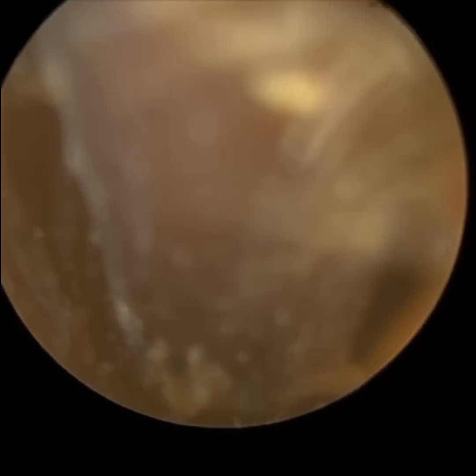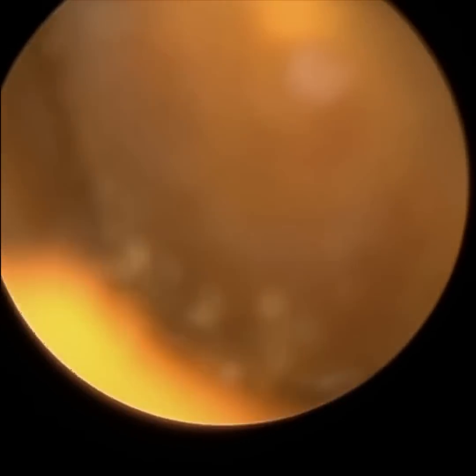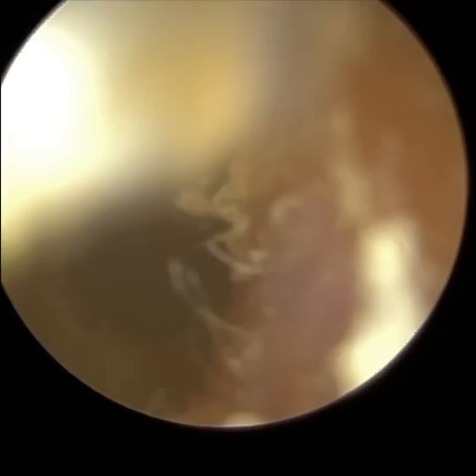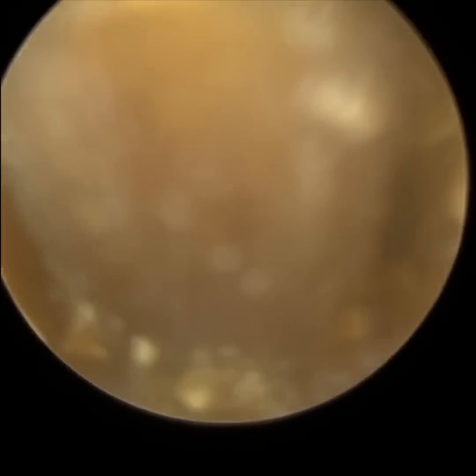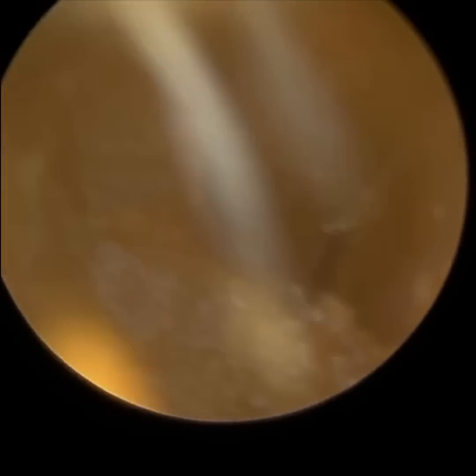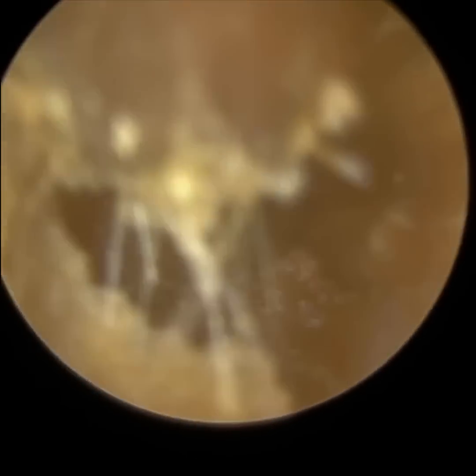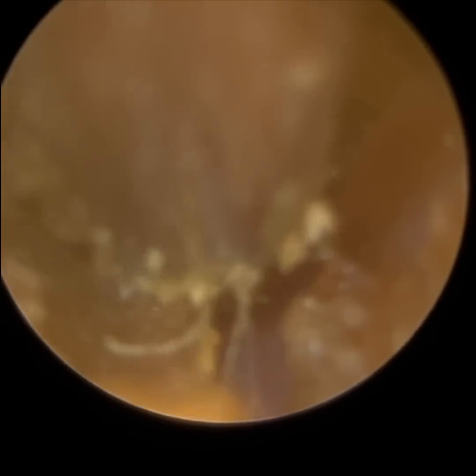So I'm just trying to lift this wax plug off the bottom of the ear canal. Now, whenever I perform a procedure, when I document the patient's procedure and treatments that we provided, I log little tips for myself in future. So if the patient returns and needs the wax removed again, I always make little notes to help me the next time. And in this case, I've left a note over the years after treating this patient's ear that the key to this is trying to remove this from the bottom of the ear canal. That's the key territory. If I detach this from the base of the ear canal, it just makes the whole procedure far simpler. And as you can see, I'm just targeting the bottom of this ear canal. I'm trying to separate it.